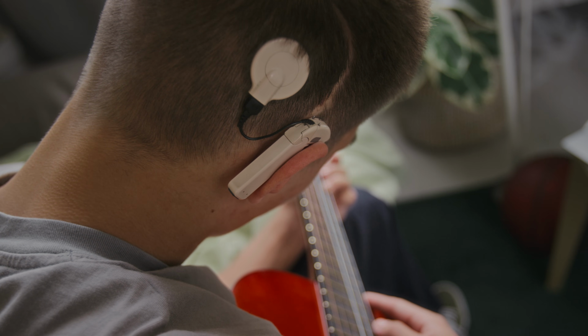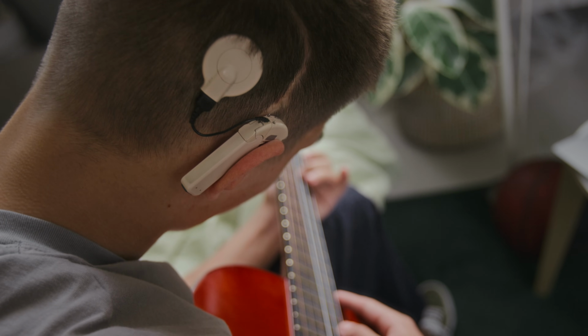Now, cochlear implants are the closest thing that I have seen to a medical miracle. They are basically capable of taking someone who has absolutely no hearing in one of their ears and allows them to hear again. However, just like my patient, there are a lot of people out there who would benefit significantly from the use of a cochlear implant. They just don't want to have to wear the external processor.